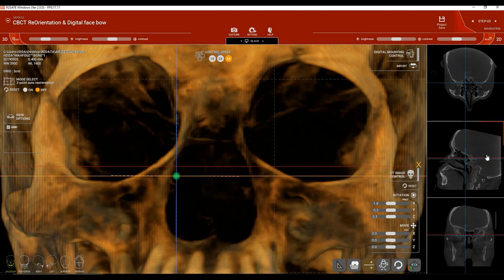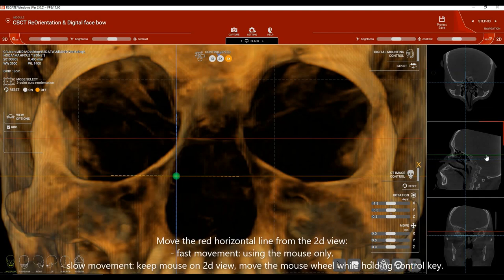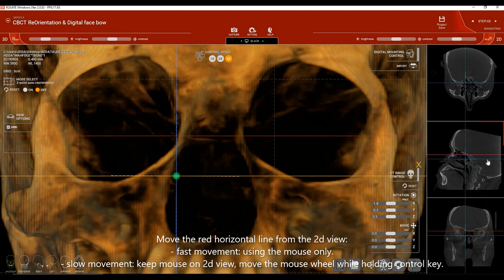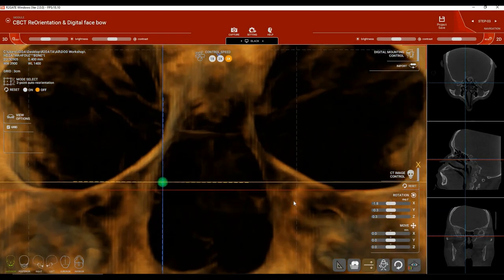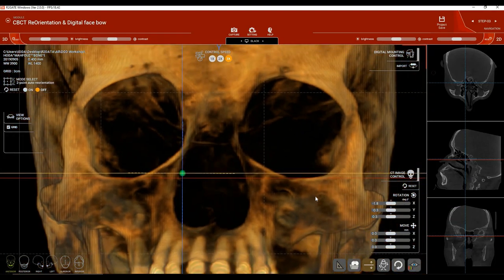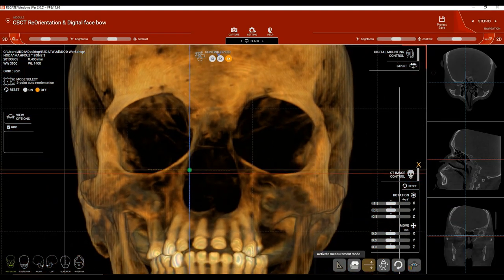The red line can be moved by dragging it from the 2D view on the right side for fast movement, or you can hold CTRL on the keyboard and use the mouse wheel — pressing CTRL slows down the line movement for fine adjustments. Once both orbital floors appear on the same line, that first step is complete.